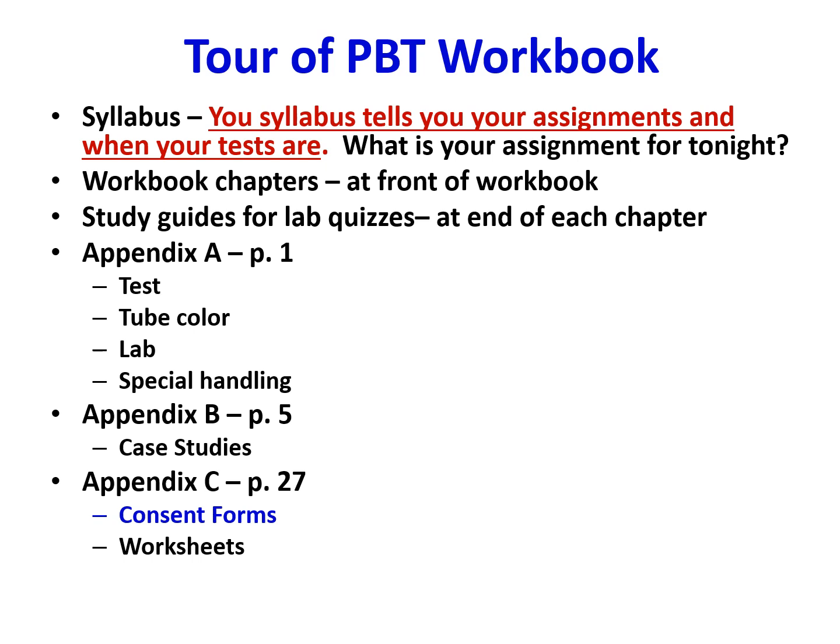It's going to tell you the name of the test. Let's just say electrolyte profile. That's the name of the test. It's going to tell you the tube colors that you can draw that test in. So let's say for electrolyte profile, it's red, green, or SST. It's going to tell you what section of the lab you take that test to, which in this case would be chemistry, and any special handling that you need to be aware of with this specific test, such as making sure that the specimen is non-hemolyzed. You will need to memorize all that stuff.